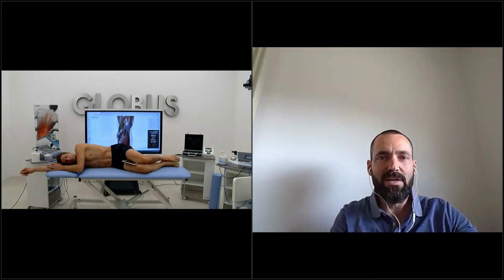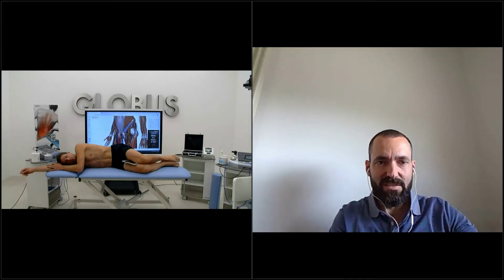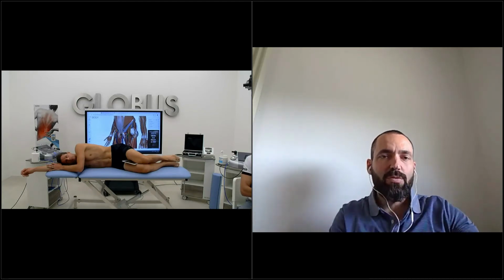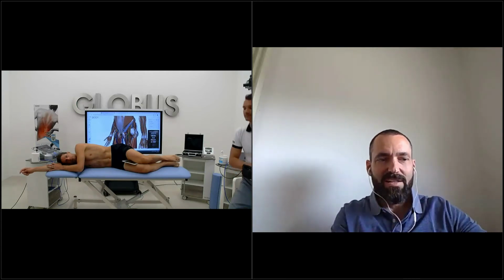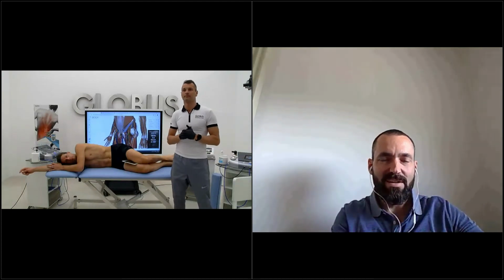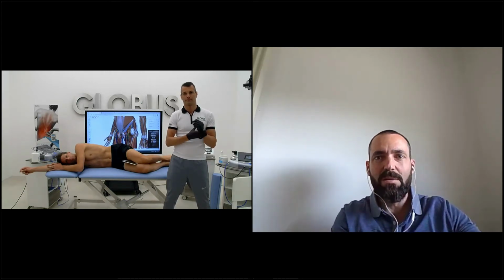If I create some inflammation around the area, as I said before, inflammation that I wanted to create to improve blood circulation and oxygenation of tissue, I wait 1 or 2 more days. But of course, every time we see our patient, we have to make a continuous evaluation. You cannot evaluate on the first day of treatment and plan all the treatment. Every day when you see the patient, evaluate again and decide which technique, how to treat, what you're going to use, heat treatment or not heat treatment, 1 day pause, stop, depending on the reaction after the treatment.